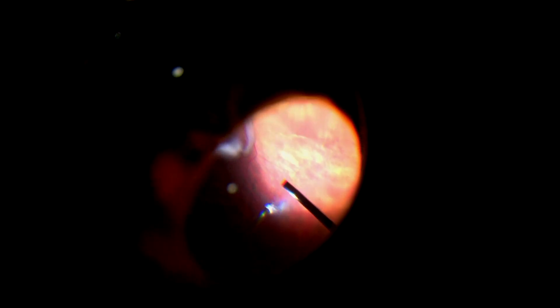I want to clean this up really well, as this is a long 29-millimeter eye and you want a really good vitrectomy here. When the vitrectomy is completed and I've gone way out to the vitreous base and removed everything, I'll do scleral depression. Then I'm going to come back and go after the lens itself.